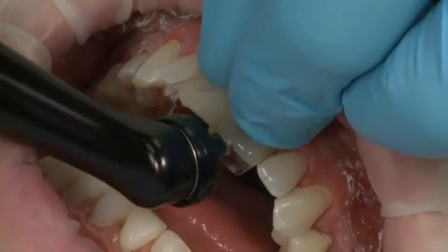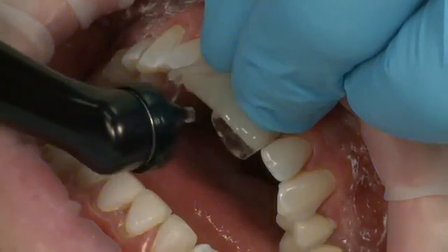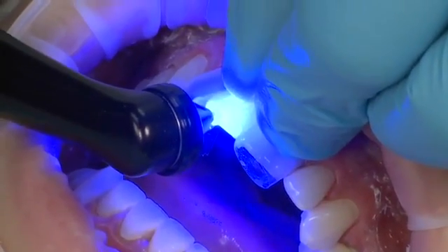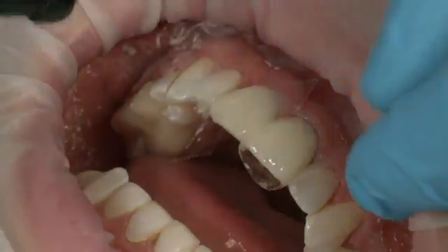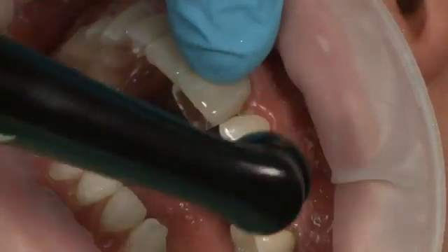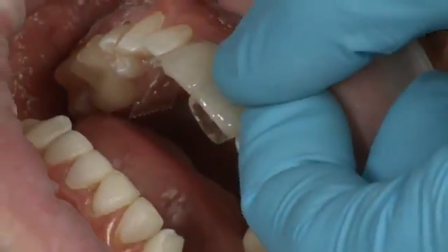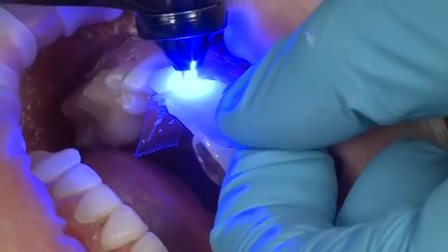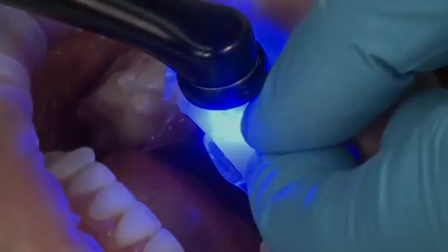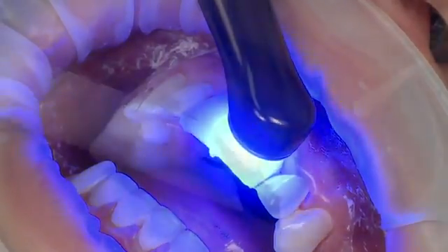With a point cure lens, tack cure the Edelweiss composite veneer to the tooth at the incisal edge with Velo for 3 seconds on standard power mode, or 6 seconds if using a curing light with an output less than 600 milliwatts per centimeter squared. Remove excess composite from the rest of the margins. Pull the Mylar strip across the facial surface of the veneer from the mesial and distal surfaces and cure the composite through the Mylar strip. This will give a better contour to the composite and prevent the oxygen-inhibited layer. Prior to final cure, Deox can be placed on the gingival margin to prevent the oxygen-inhibited layer.